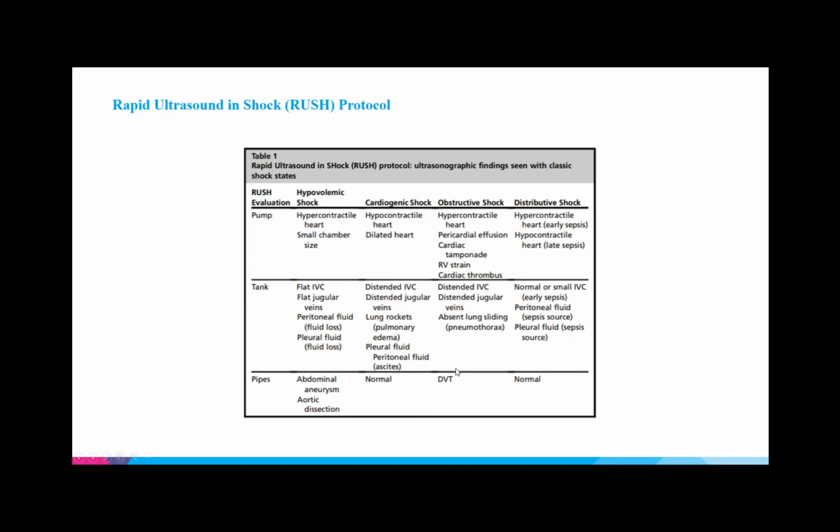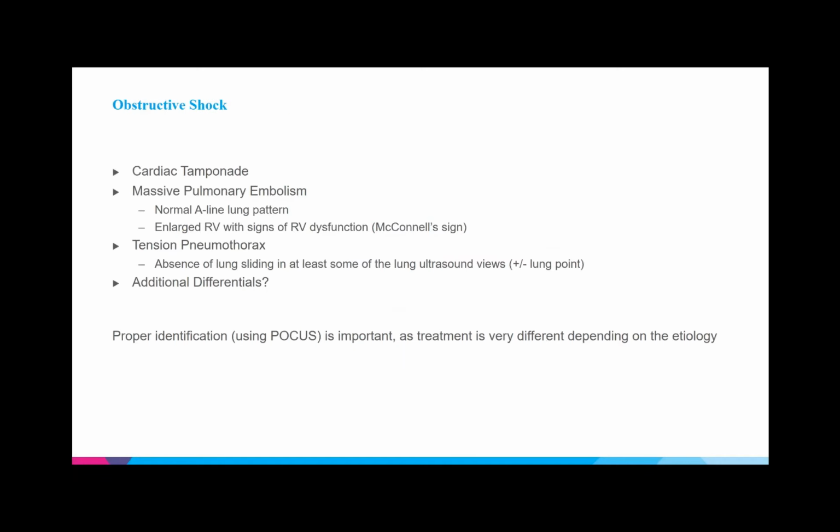I think in the medical ward, you probably won't necessarily need to use this, but it's just a way of evaluating the patients in a holistic manner. So, starting with the specific types of shock, the first one we'll start with is obstructive shock. I've included some examples of the most common types that you'll encounter in the medicine wards or in the ICU setting.